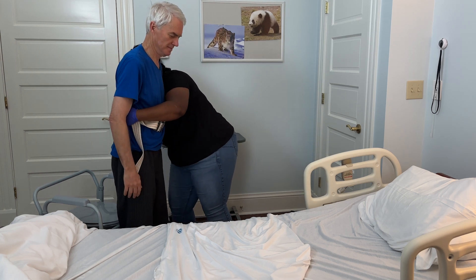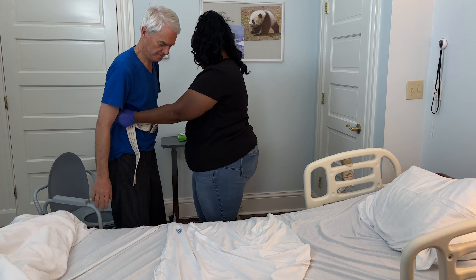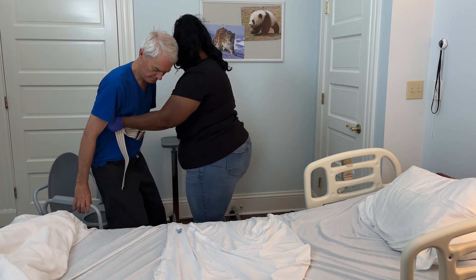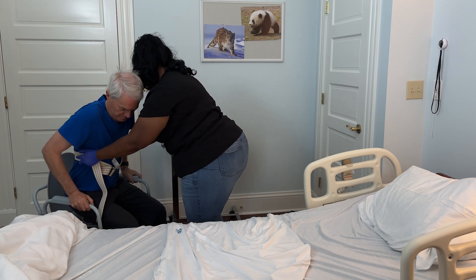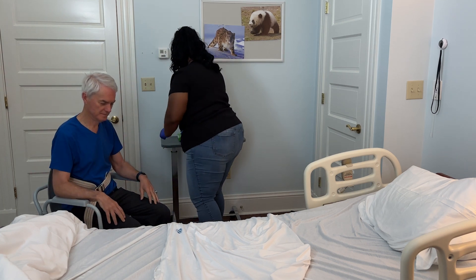Then, pivot them towards the bedside commode in a smooth motion. Guide your loved one to feel the bedside commode behind them and to place their hands on the armrests. Then assist them in lowering down to the bedside commode. Continue to hold onto the gait belt, bending at your knees as you lower your loved one onto the bedside commode.